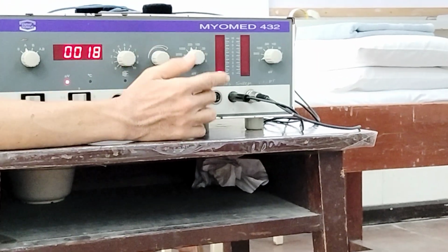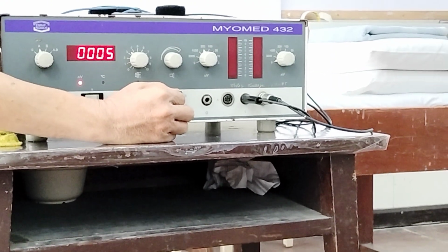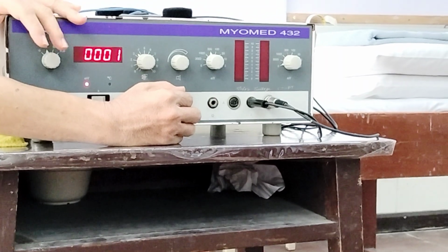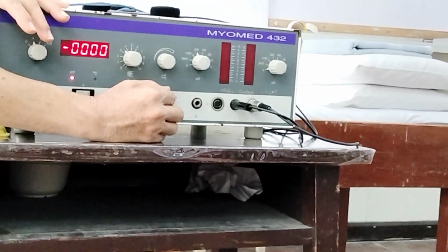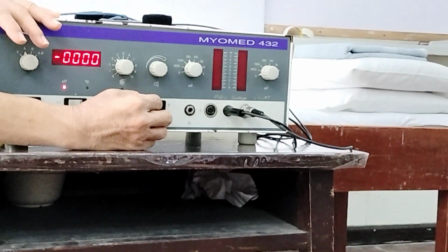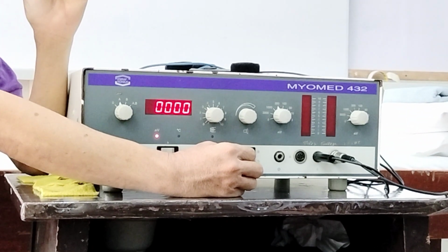So your goal now is that the involved side or affected side should reach from 10 microvolts, kaya na ma-reach niya ang 5 or level 5 or 50% of the 300 microvolts. Okay? So that would be our basis if unilateral affectation. So base it on the good side. Okay.